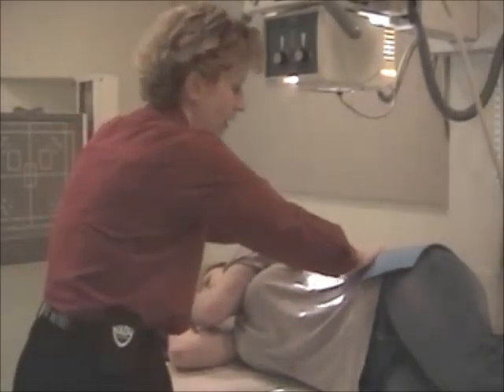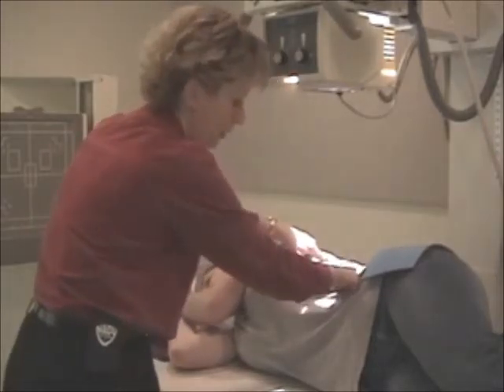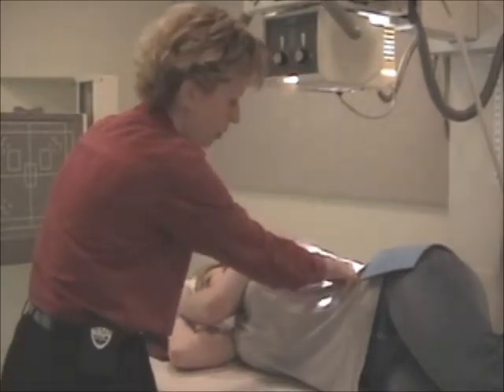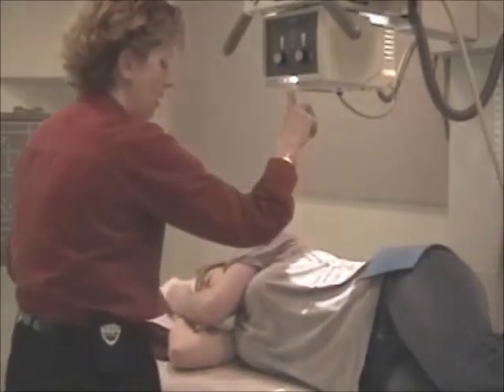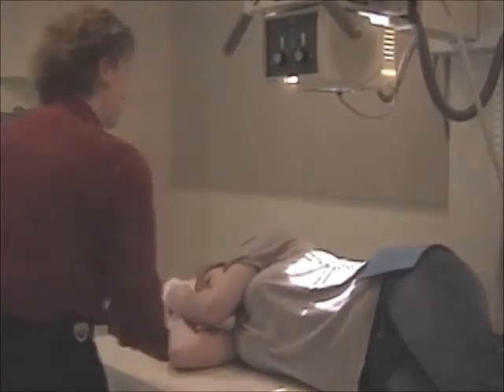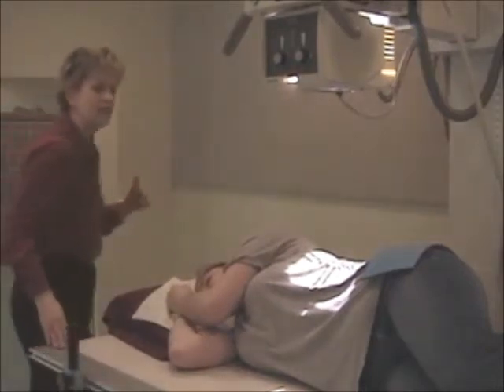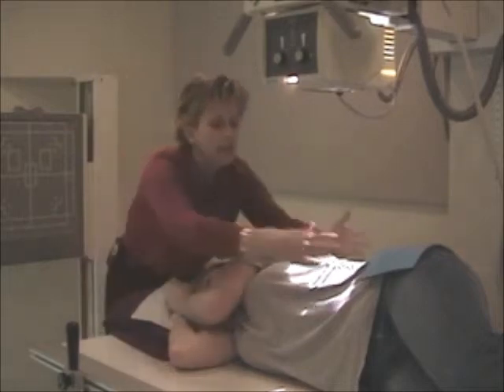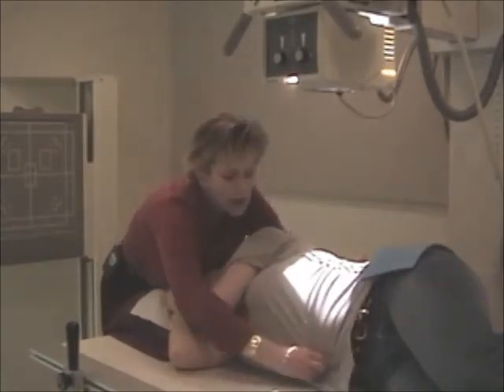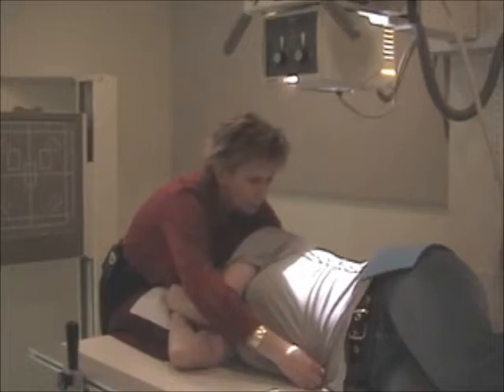You can confirm by iliac crest. 2 inches above is L3, so you can see that I am approximately at L1 or L2. That's for the vertical placement. And I consider Kristen to be a sthenic body habitus, an average level body habitus. Now, the front and back plane, I'll try to tighten her sweatshirt here a little bit.